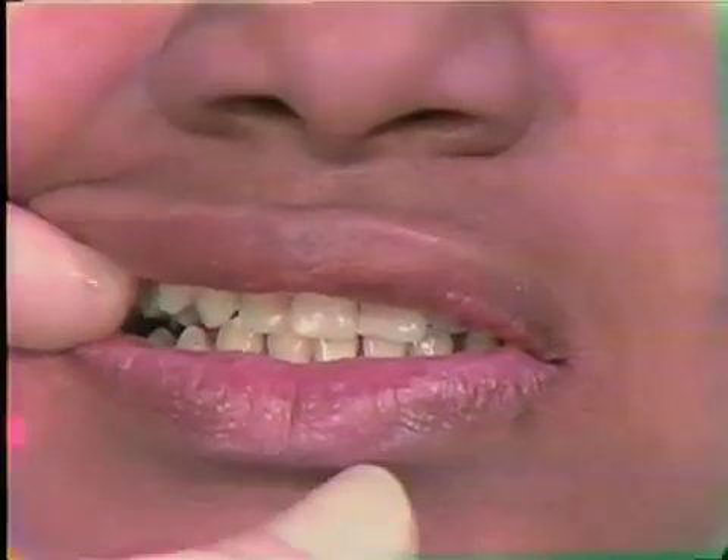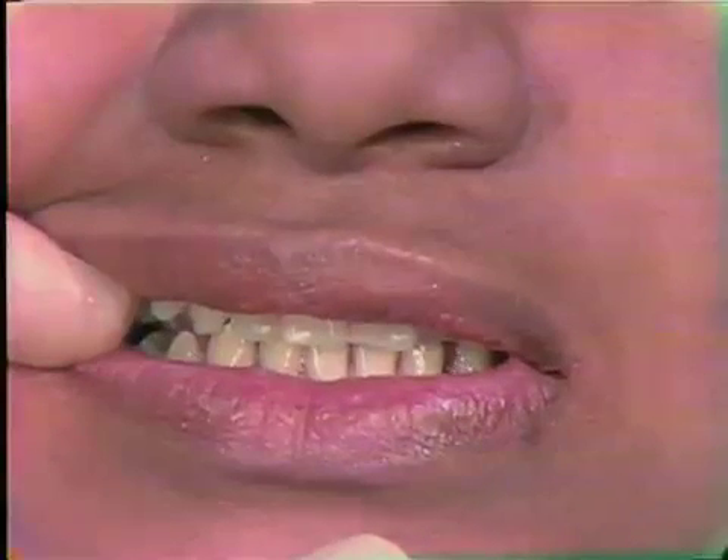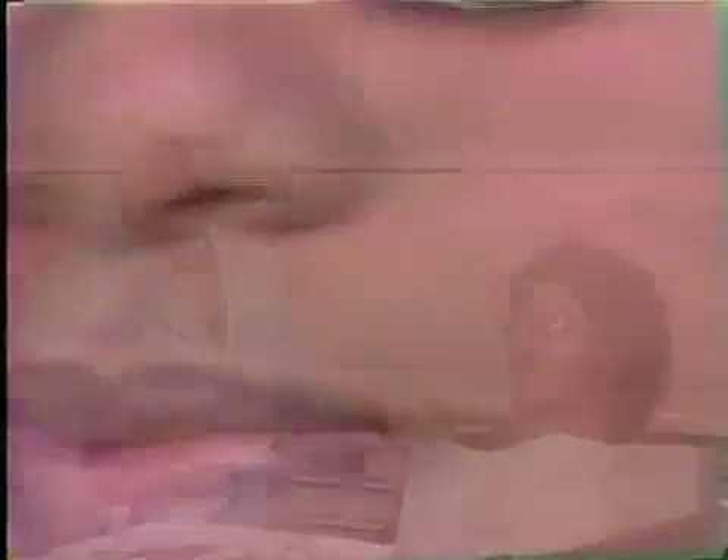Close your back teeth together as well as you can. Do you have any difficulty chewing? No. Do you use the appliance when you're eating? Yes, I do. Obviously, the patient is getting along very well with this appliance, and with the exception of the intrusion, there seems to be no other problem.